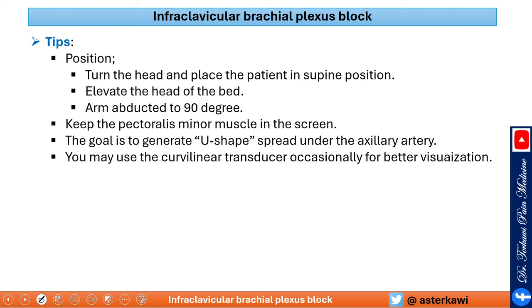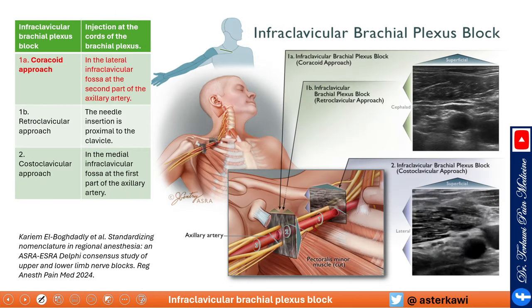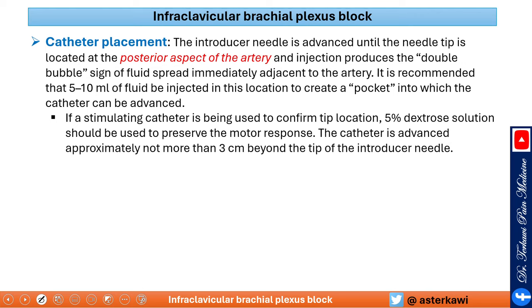You may use a curvilinear transducer for better visualization in morbidly obese patients. There are three reported approaches: the vertical infraclavicular approach, inserting the needle immediately inferior to the clavicle; the coracoid approach — the most commonly performed and personally recommended approach — inserting about 2 cm medial and inferior to the coracoid process; and the retroclavicular and costoclavicular approaches. The coracoid approach allows visualization of the pectoralis minor. For catheter placement, place the tip at the posterior aspect of the artery (six o'clock). Use dextrose 5% rather than saline to open up the space if using a stimulating catheter to ensure proper nerve conduction.